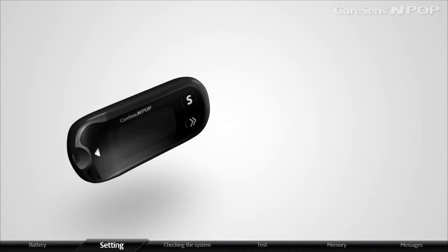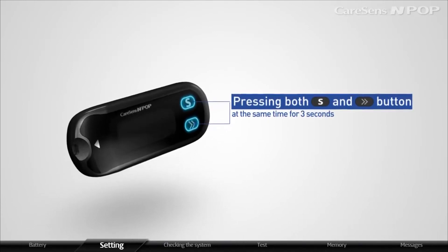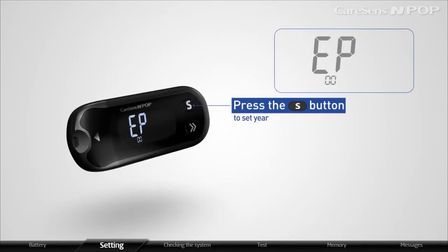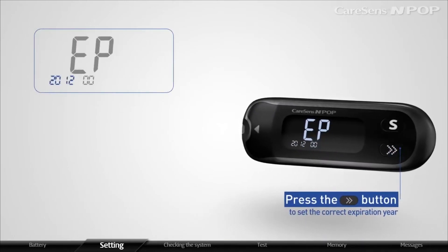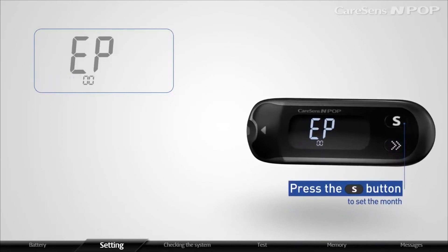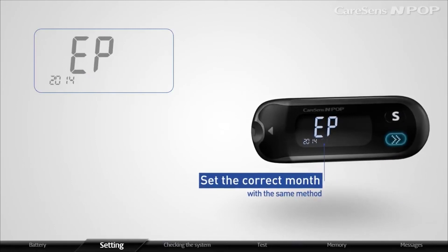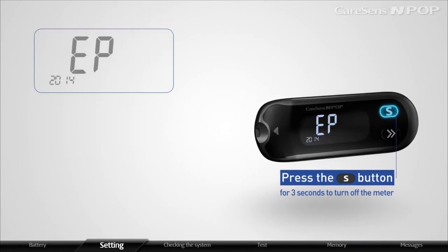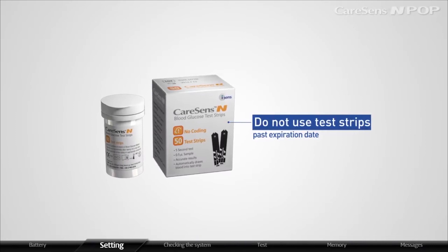The meter will display all features and then EP when pressing both the arrow and S button at the same time for 3 seconds. Press the S button to set the year. If the year blinks, press the arrow button to set the correct expiration year. After setting the year, press the S button to confirm. Set the correct month with the same method, and press the S button for 3 seconds to turn off the meter. Do not use test strips past their expiration date.